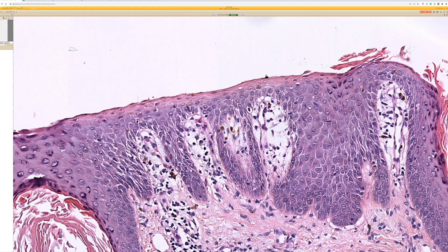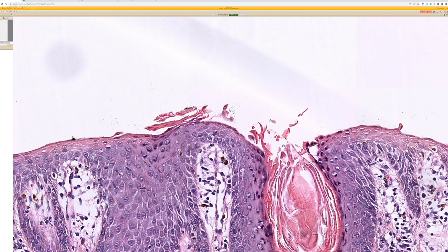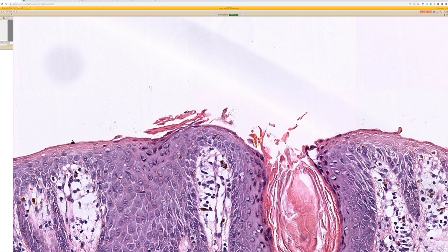The main things to consider: when the corneal layer is missing and I see evidence of acantholysis, that means we have an acantholytic blistering process. Either it's autoimmune — in which case it would be pemphigus foliaceus, which is what this was — and you would need direct immunofluorescence to confirm that. The other thing that can look like this is staph scalded skin syndrome, which also has acantholysis and detachment of the corneum. The clinical presentation is quite different, but microscopically, pemphigus foliaceus and staph scalded skin can look identical.